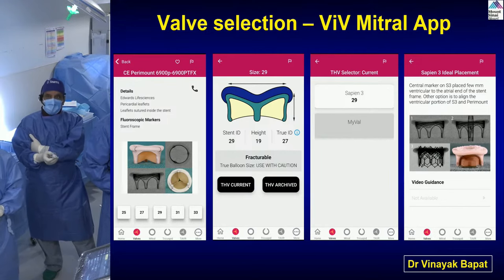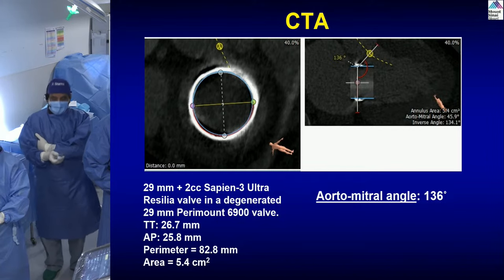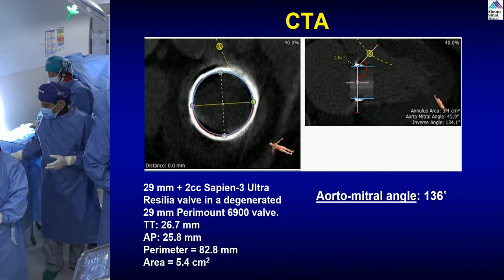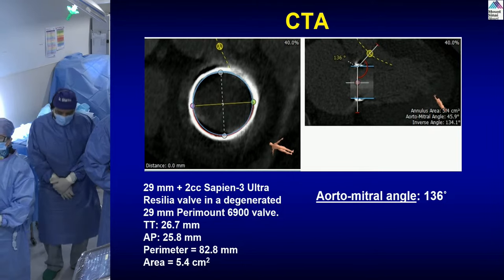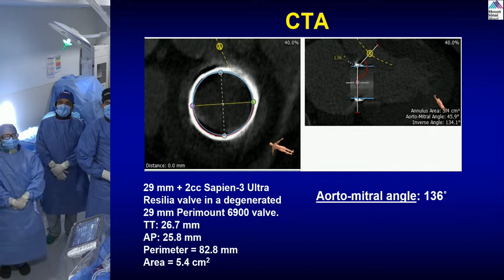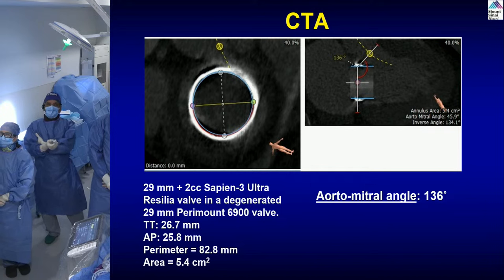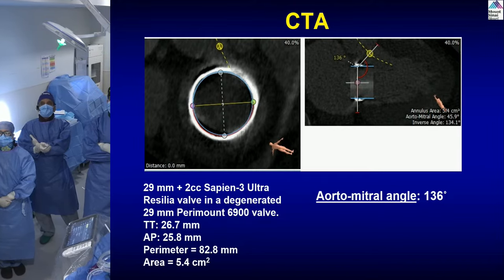Okay. So this is the 29 millimeter fit, and this is the CTA. The biggest question, as you know, in these valve TMVR devices is LVOT obstruction. And that is where many of the decisions are made on what to do. We have sometimes done an alcohol septal ablation, and many times there is leaflet tear, and all those devices are coming. But in this particular case, we felt that there is a very low chance of LVOT obstruction. Sahil, you know why? Stam already showed it in the images. It's a big LVOT. The aortomitral angle is very favorable. So I think this is one of the ideal cases to offer a TMVR valve-in-valve, relatively safe.